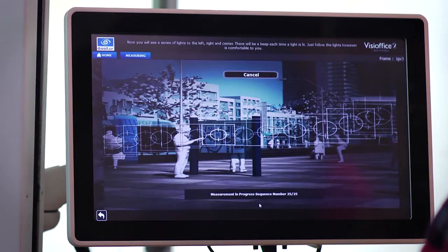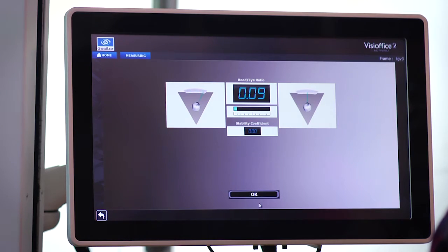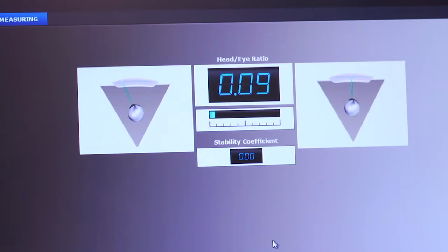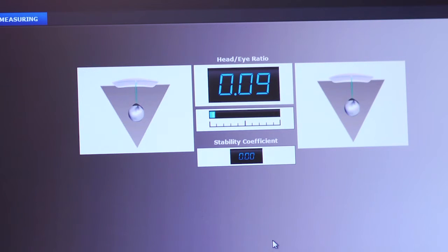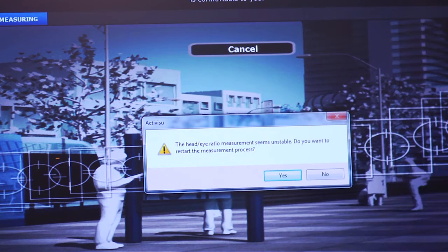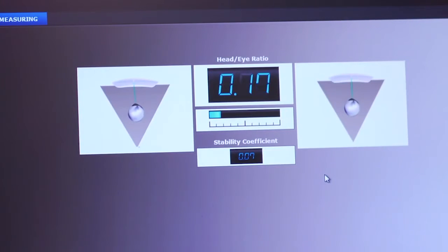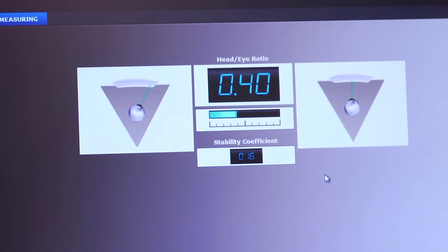When the measurements complete, the results screen will display the patient's head-eye ratio and stability coefficient. The stability coefficient should be less than 0.15. If the coefficient's greater than 0.15, it means the patient didn't exhibit consistent head or eye movement and they're not a good candidate for designs that require this measurement.